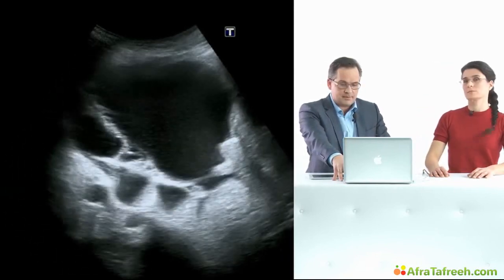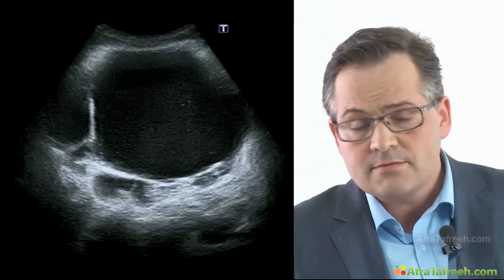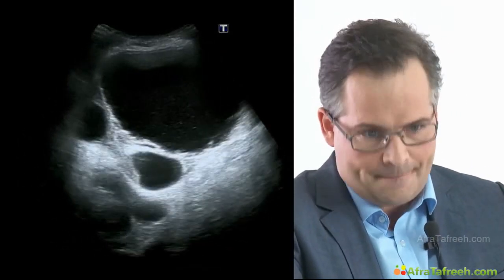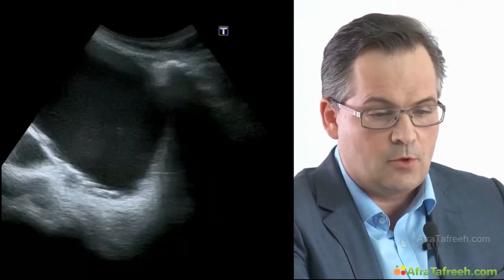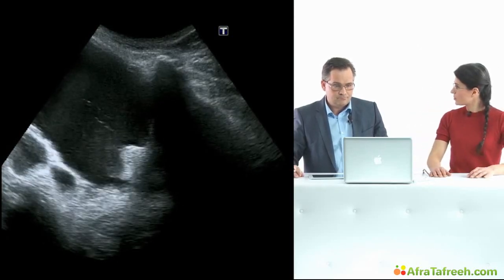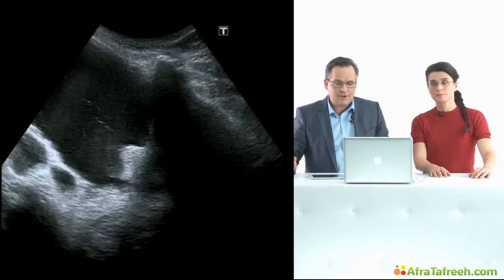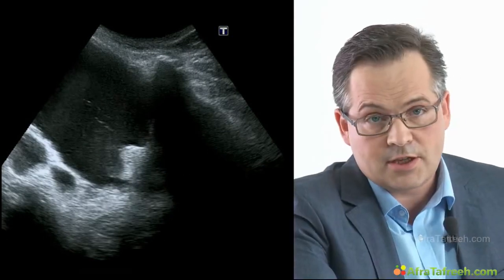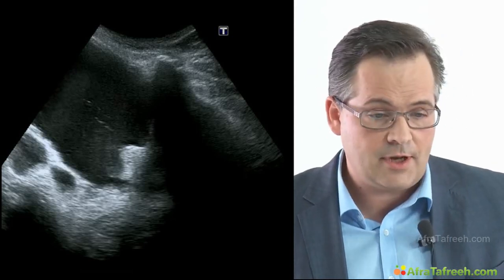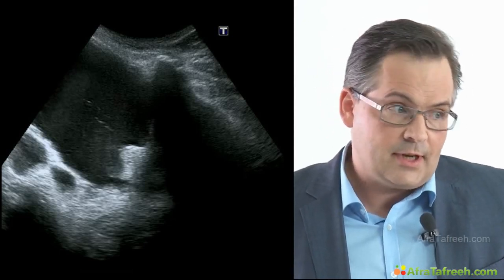That's exactly the problem. There's no catheter balloon, neither in the transversal view, as you can see here. So that means it was a dislocation? Correct. And no balloon in the longitudinal scan. We can't believe it. But quite an easily made diagnosis with ultrasound, isn't it? No, it was clear. There had been dislocation and urinary retention and pain, of course, in the lower abdomen. So we had to do it again.